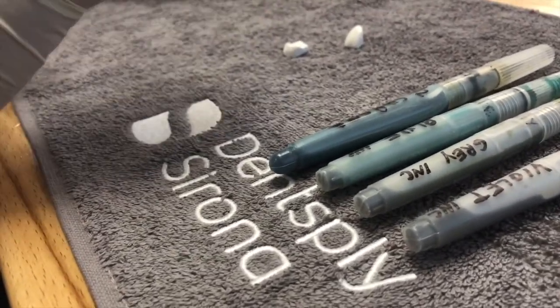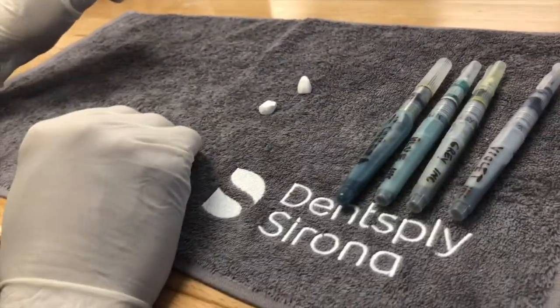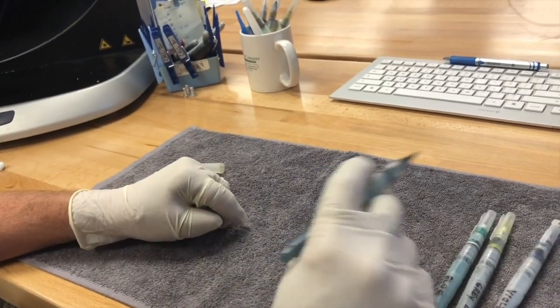We're going to enhance the shading on it by using these shades you can get from Vita or ZirconZahn. You can also get these pens on eBay or Michael's store — they are watercolor pens. You put your colors down into the body here and you're able to use them.